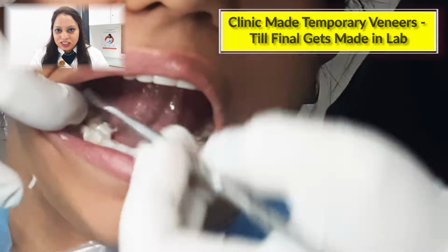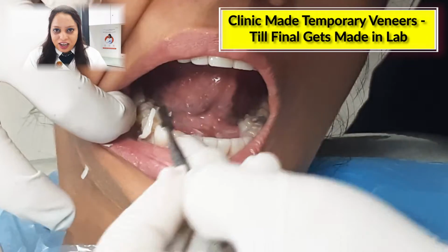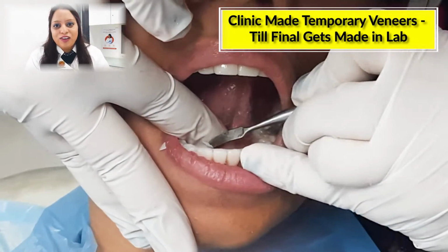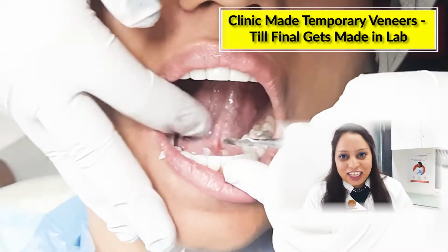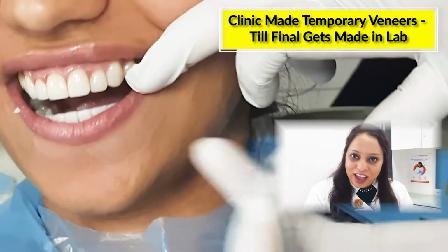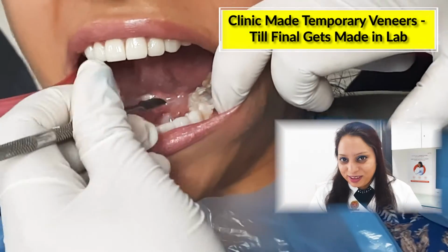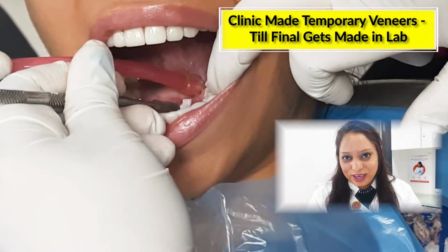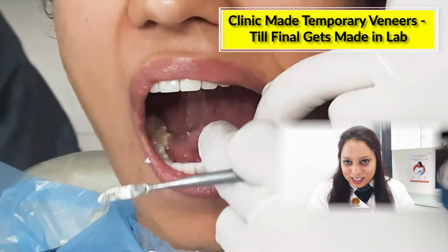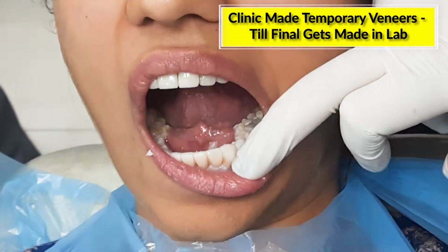After the impression, temporary veneers are made and they are glued using a temporary cement till the time we get the final veneers. These are important to protect your teeth from sensitivity, plus it gives you some vanity also. Sometimes the temporary veneers look as good as the final veneers. Upper ones are the final veneers and lower ones are the temporary veneers, and both of them are closely matching.